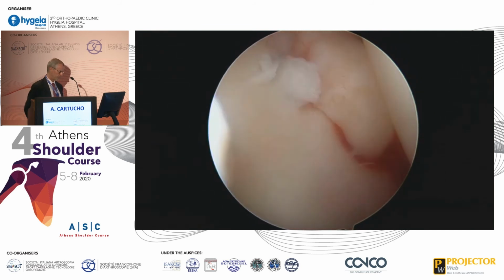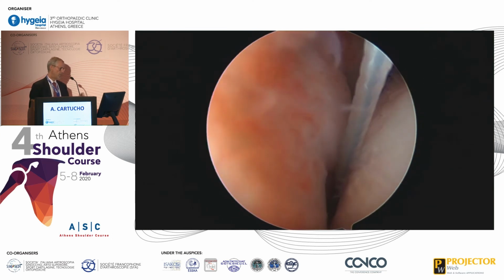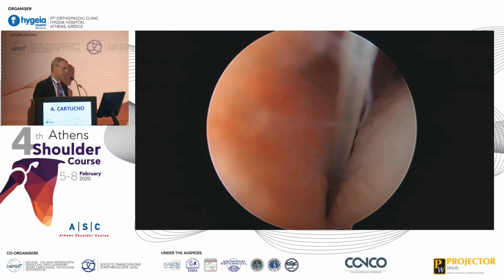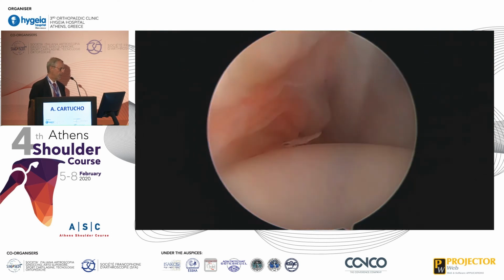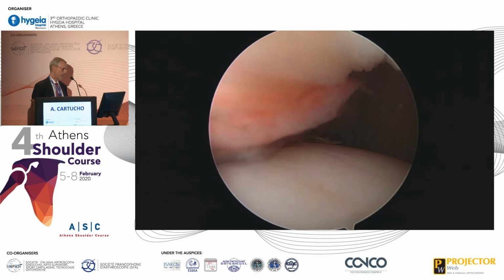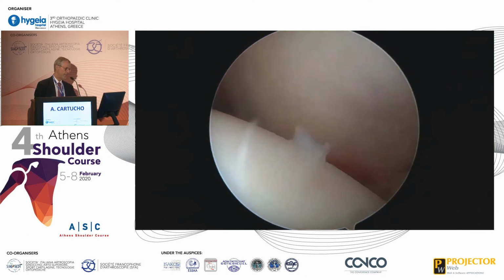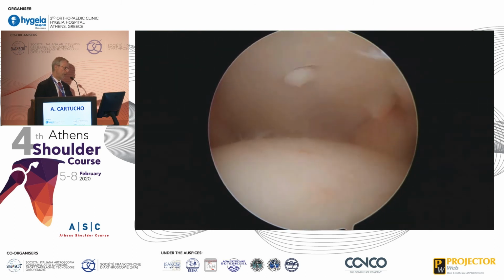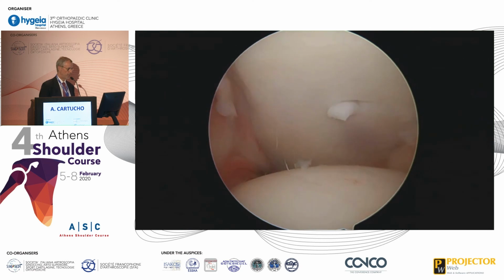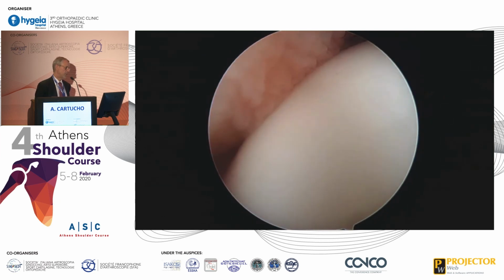So I finished with my Bankart, and now I will change my portal again. So I'll go for the superior portal, and then what I want to do is to make a tenodesis effect of my capsule and then my infraspinatus in the Hill-Sachs lesion. So now I'm doing sliding knots with my strands of the anchor, and I normally begin with the one that is more inferior. If it is the blue one, that is more inferior. Then I check that my head is balanced in my shoulder, and then it's the end of the procedure. This is the effect that I wanted to have at the beginning.